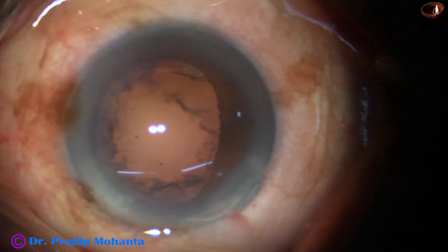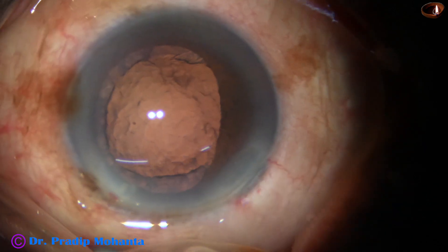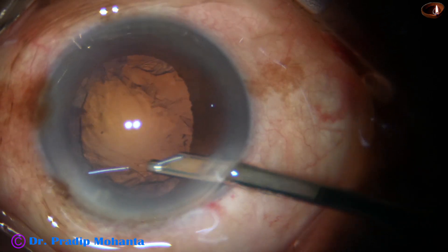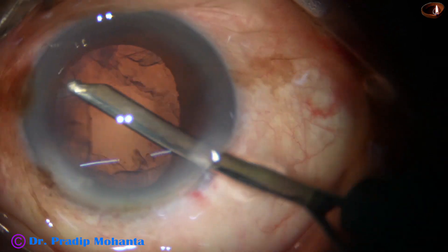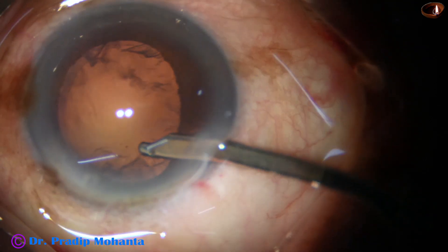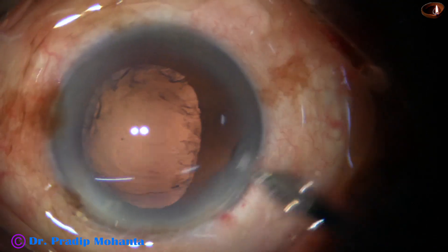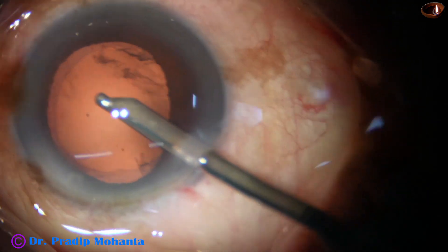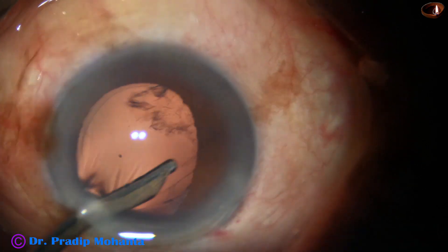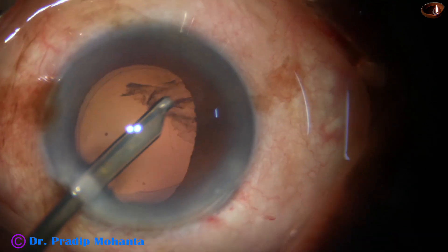The anterior chamber is again filled up with visco. If we fill up the anterior chamber with visco, we get about 45 seconds to one minute that keeps the anterior chamber formed. The viscoelastic substance comes out gradually — not suddenly like aqueous — keeping the AC formed so we can remove the cortex nicely. I go through the side port and remove the rest of the cortex.